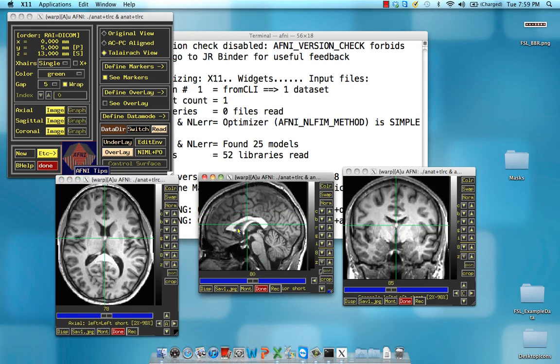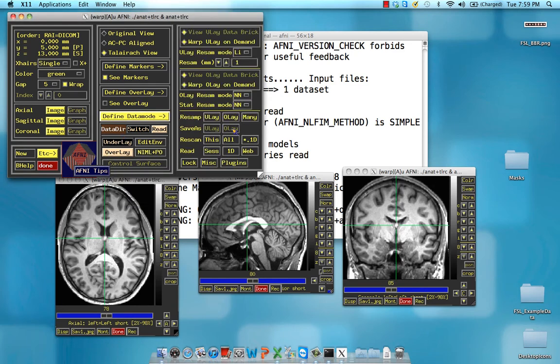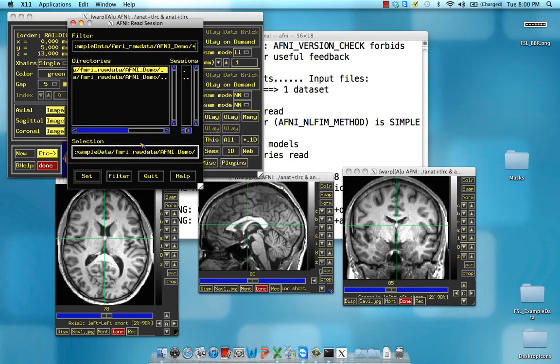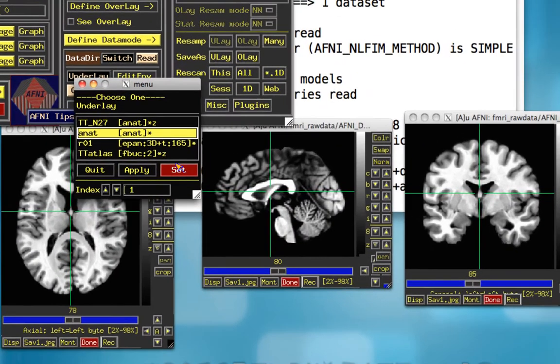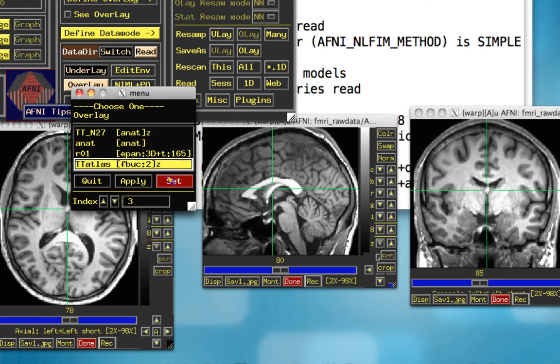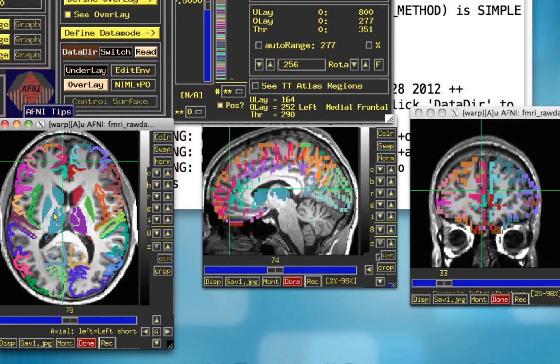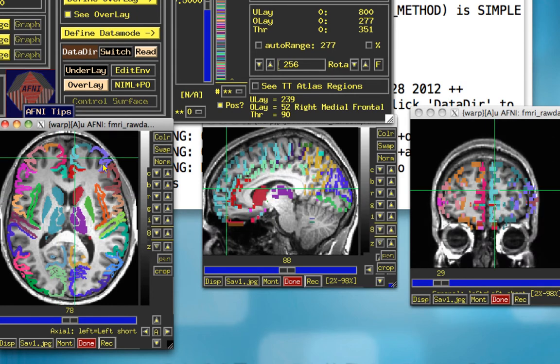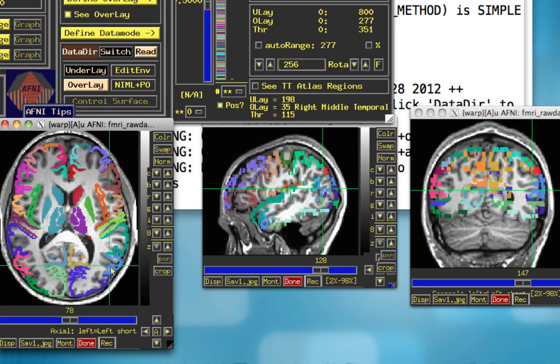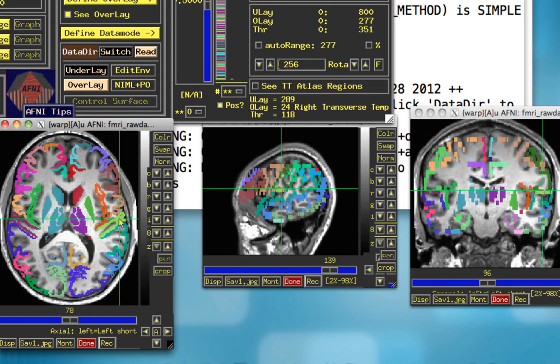We can apply these same warps to child data sets — other data sets that might be in alignment with our anatomical image. To verify and double-check the goodness of fit of this transformation, I have some sample Talairach templates loaded. Setting the underlay to the anatomical data set and the overlay to the TT Atlas, this color-codes the key parts of the gray matter and some of the basal ganglia. The outline is roughly good, though not as good as it could be, as it doesn't follow along well into the sulci and inner areas. So it does an okay job.